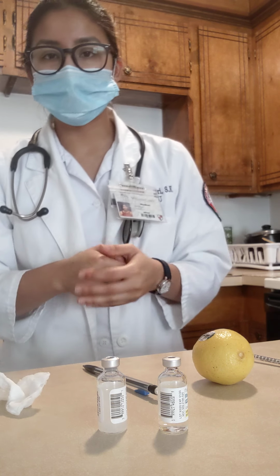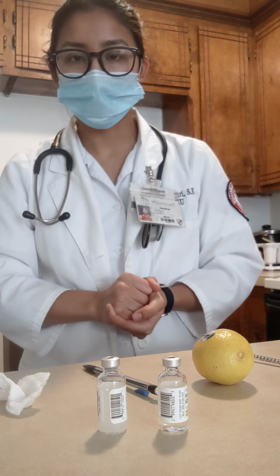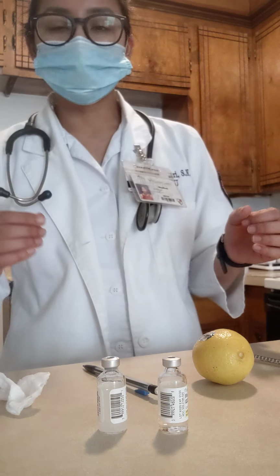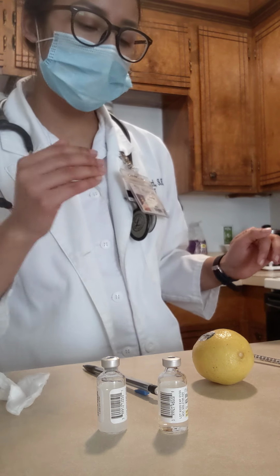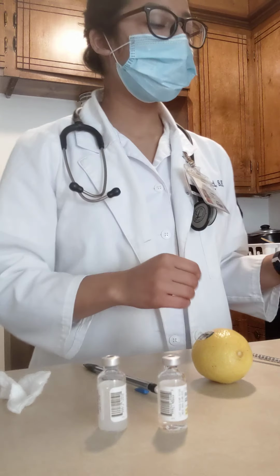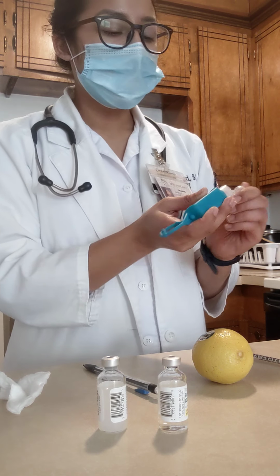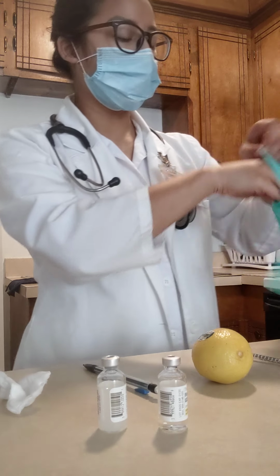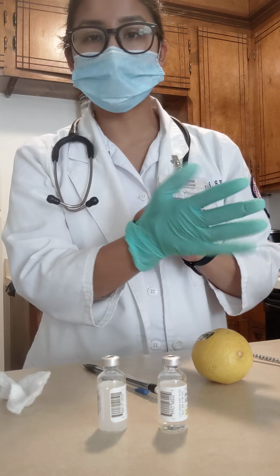Now the second part of the video is going to be insulin administration. The first thing I'm going to do is verify the order, and then identify my patient by their last name and the date of birth, January 1998. Since this is my correct patient, I'm going to do hand hygiene.